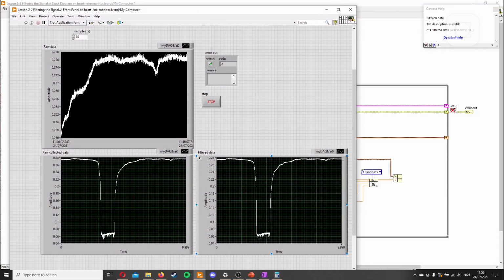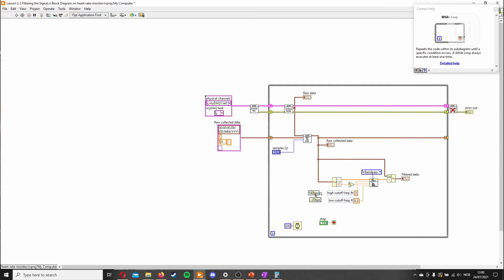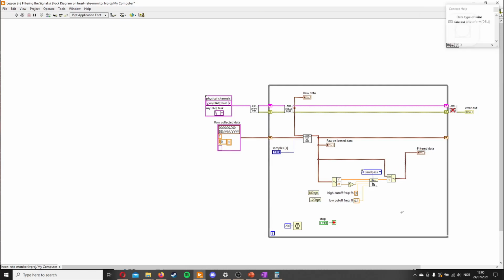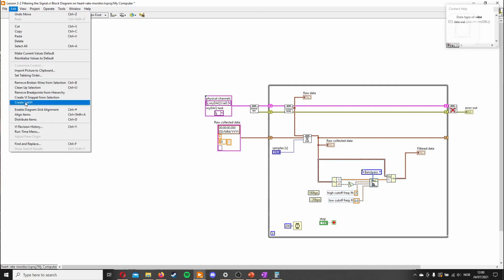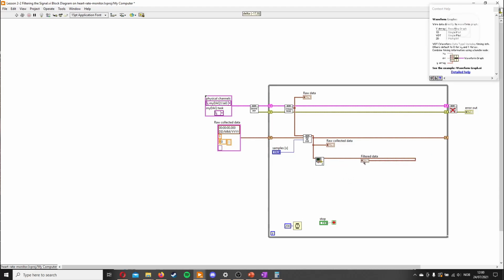Then to find it on the block diagram, you can just double click it and you'll get directly to it. And there you go. Here we have our little filter. And there we go. Now we have it inside a VI. Now we can just place it like this, and it looks much better.